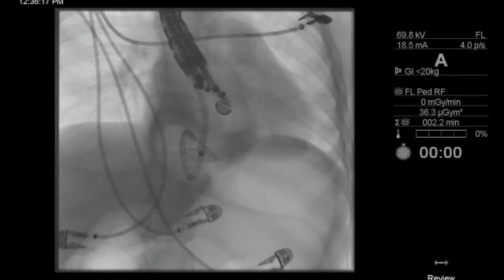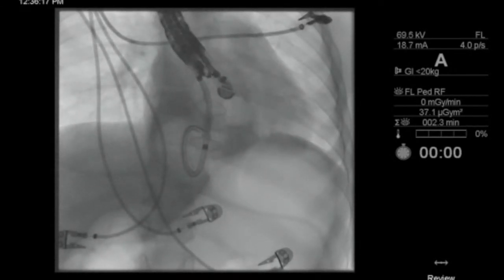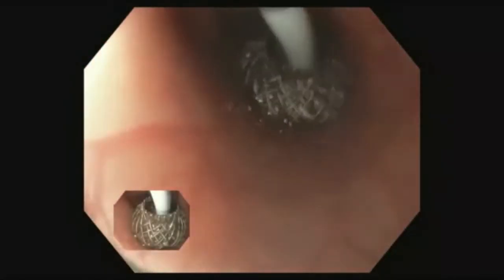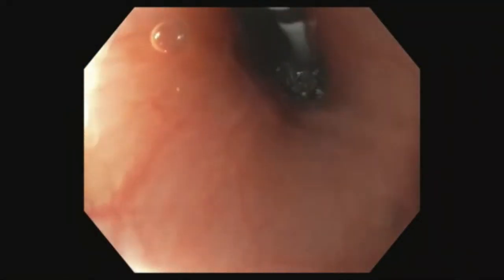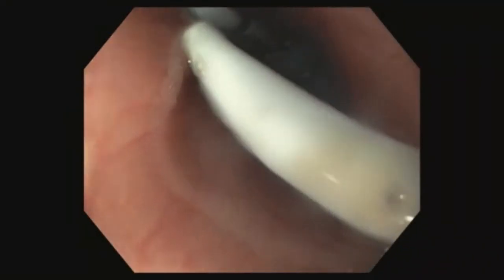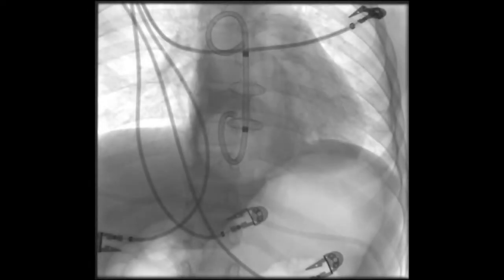The collection was again accessed with a guide wire via the lumen-opposing metal stent. A 10-French by 4-centimeter long double pigtail plastic stent was placed within the lumen-opposing metal stent to provide anchoring.